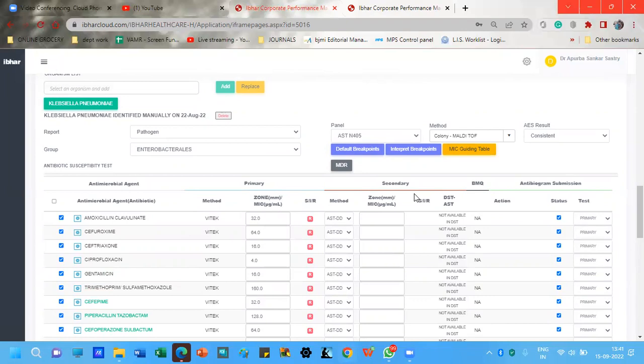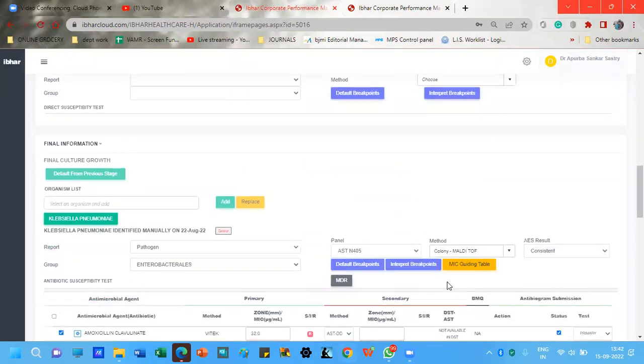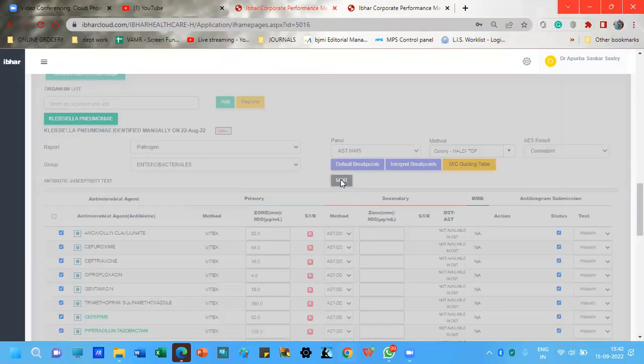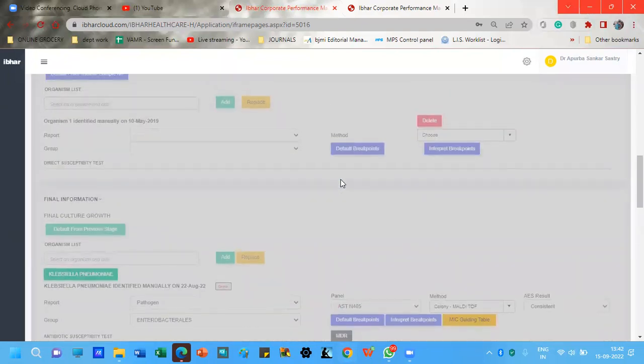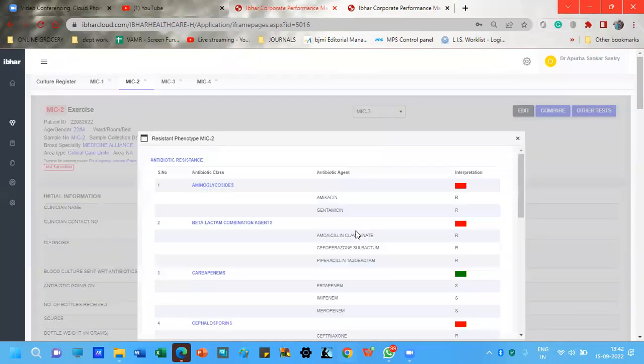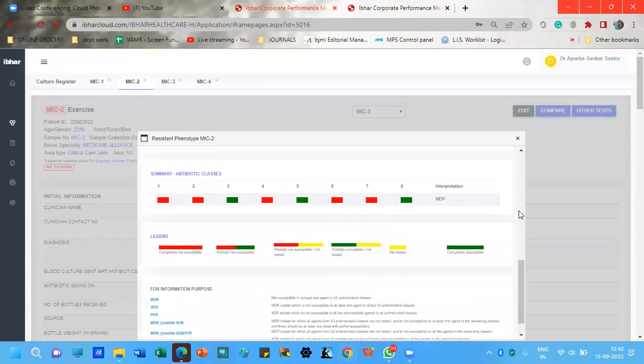So that's it for the presentation. In the subsequent videos, I'll be making a video on how to go about the resistant phenotypes. As you can see, once I entered the results, it also interpreted the resistant phenotype. How to find out which resistant phenotype it belongs to, I'll discuss in the subsequent video. Thank you for your patient listening.